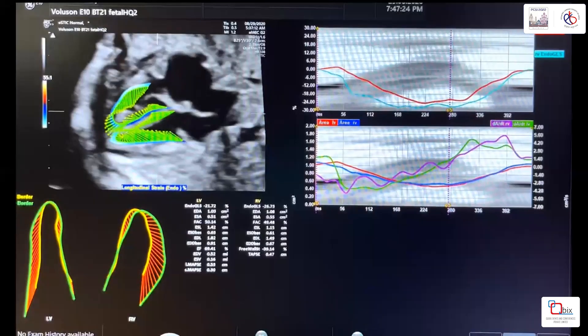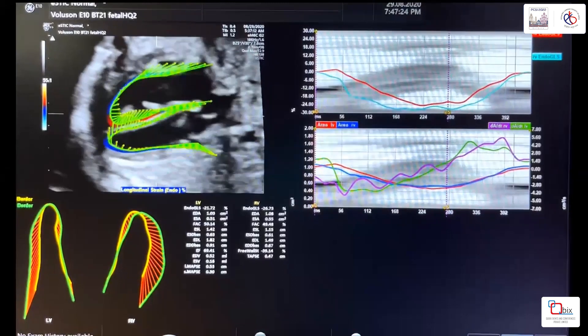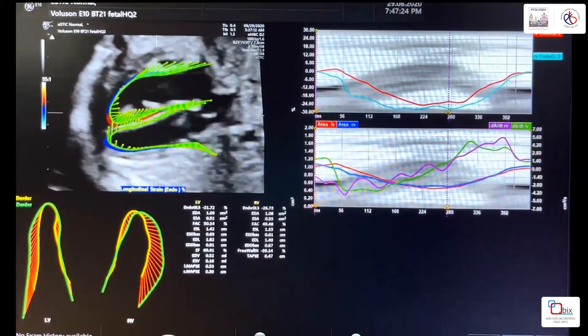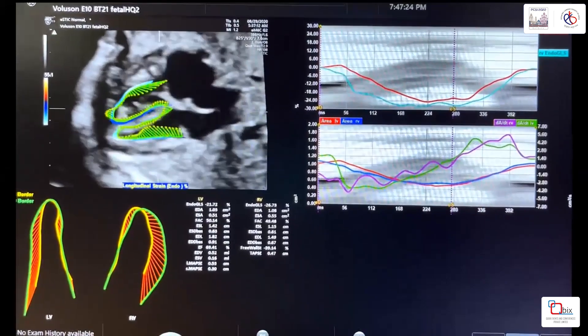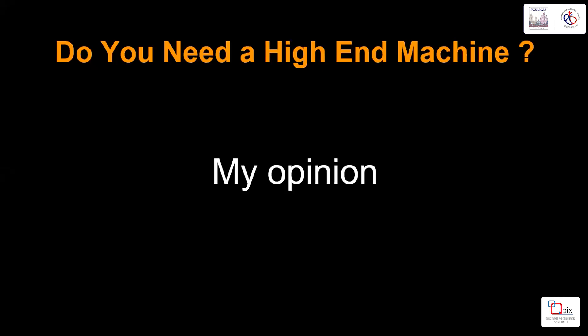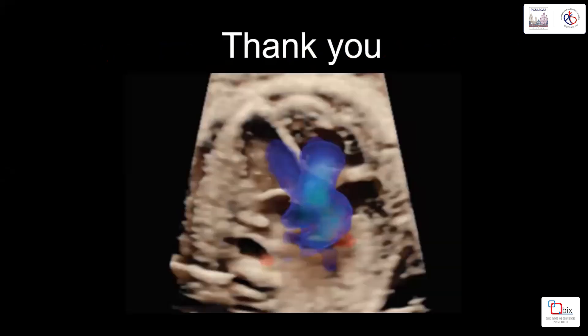A new software called fetal heart quantification provides all parameters of cardiac function within just two or three minutes. In conclusion, do you need high-end machines? In my opinion, yes — not for regular work, which can be done with mid-level ultrasound — but if we want to go beyond routine work, we need high-end machines. Thank you.